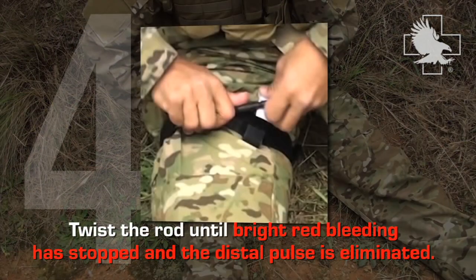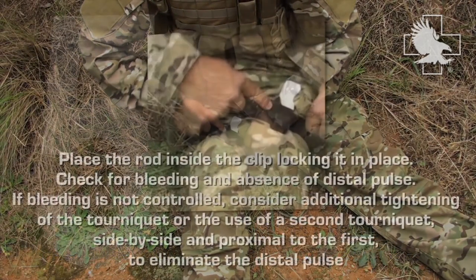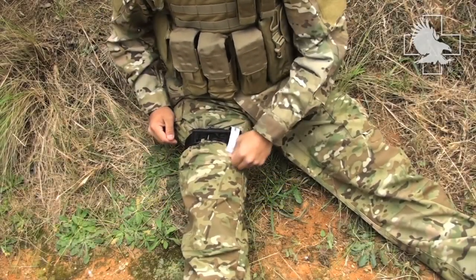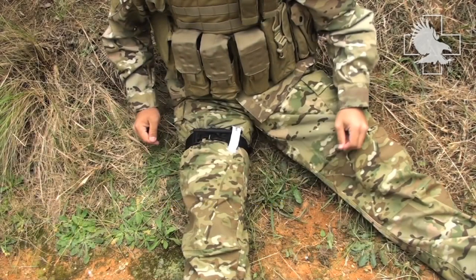Twist the rod until bright red bleeding has stopped and the distal pulse is eliminated. Place the rod inside the clip, locking it in place. Check for bleeding and absence of distal pulse. If bleeding is not controlled, consider additional tightening of the tourniquet or the use of a second tourniquet, side by side and proximal to the first, to eliminate the distal pulse. Secure the rod inside the clip with the strap. Prepare the patient for transport and reassess. Record the time of application.